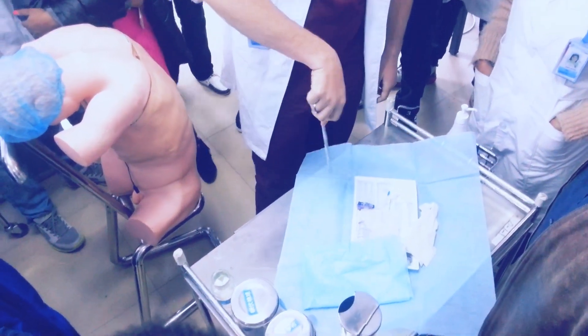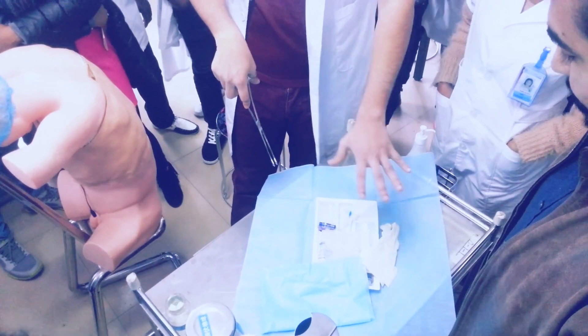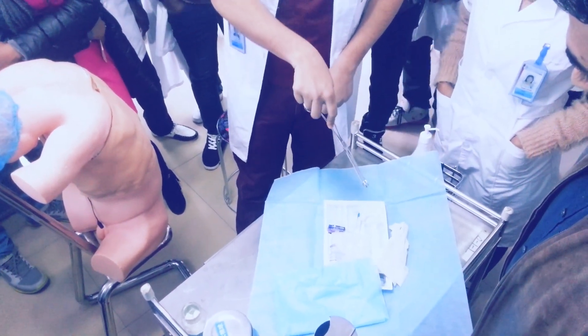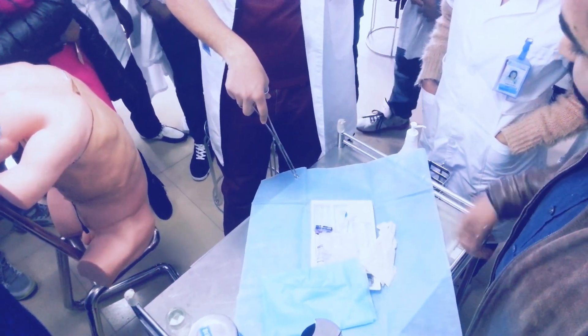Even when I am not wearing gloves, I will not touch any of the instruments — even these. These are my gloves. Do you have to wear gloves? No.